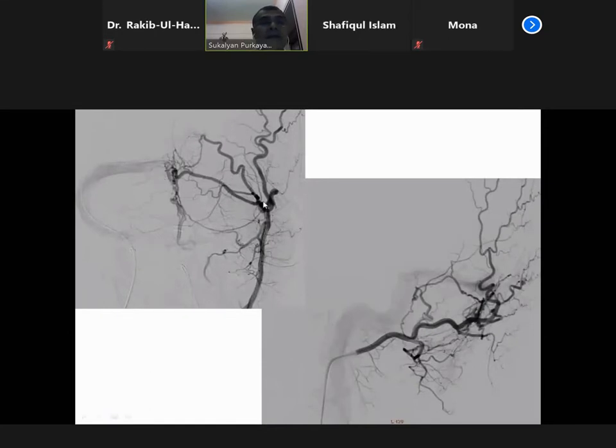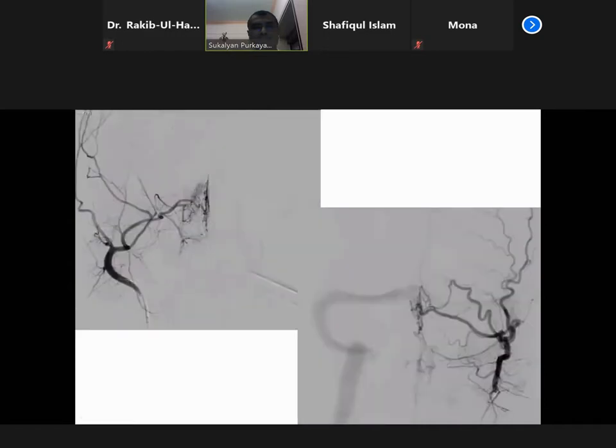You can see that although this is the occipital artery, it is quite a straightforward artery here. Check all the vessels: occipital artery, middle meningeal artery, and out of these this was the only nice supply, and this is the area of the fistula. You can see that there is direct venous drainage into the foramen magnum region and going down into the spinal perimedullary veins, and those flow voids we saw in the spinal cord were these perimedullary veins.